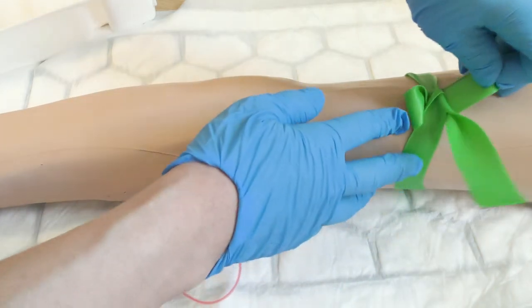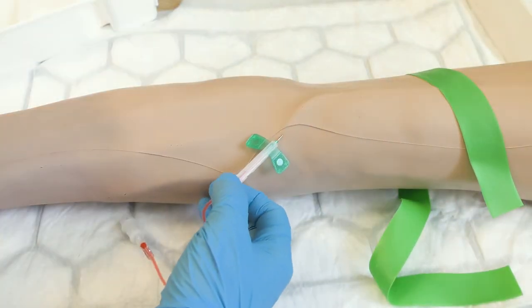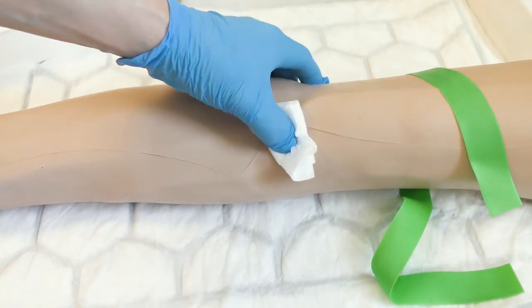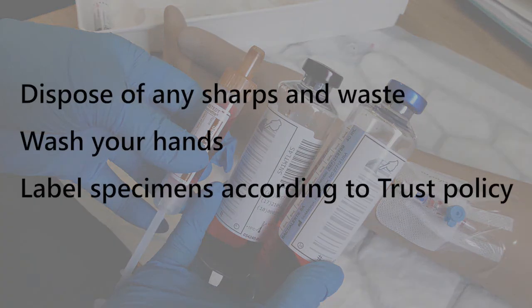After blood sampling, release the tourniquet and prepare a piece of gauze. Remove the needle applying the safety guard and apply pressure at the site with gauze. Dispose of any sharps and waste. Wash your hands and label specimens as per trust policy.